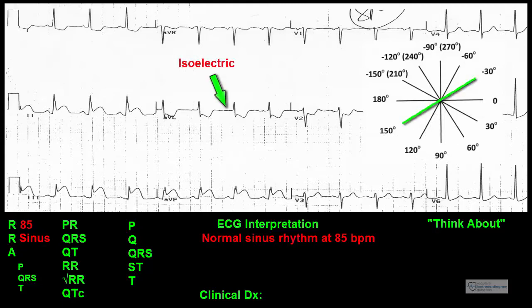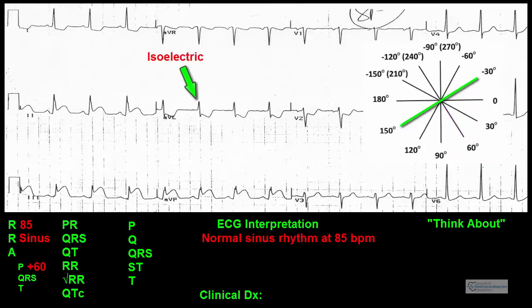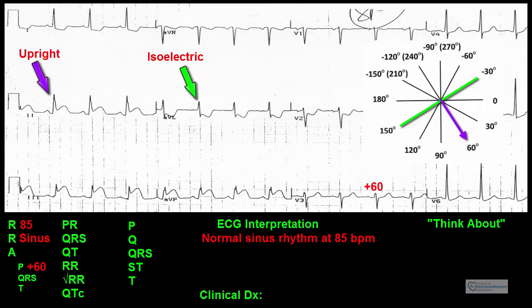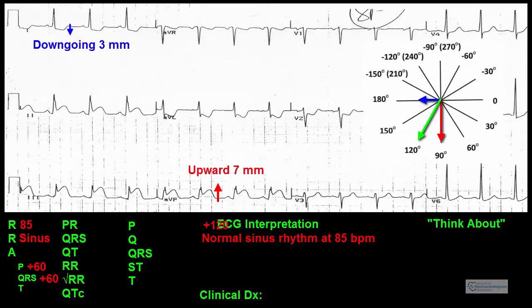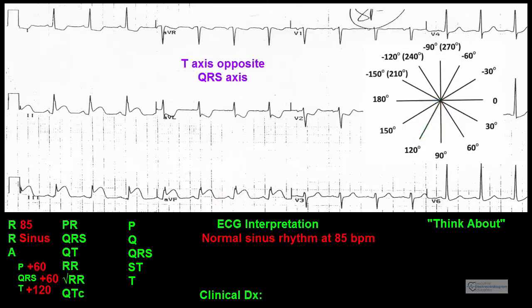Axes: The P waves are isoelectric in lead AVL and upright in lead 2, so the P wave axis is positive 60 degrees, which is normal. The QRS complexes are also isoelectric in lead AVL and upright in lead 2, giving a QRS axis of positive 60 degrees, which is also normal. The T waves are down-going approximately 3 millimeters in lead 1 and upward approximately 7 millimeters in lead AVF, suggesting the T wave axis is around positive 120 degrees. This is somewhat opposite to the QRS axis and will be put into the think-about section.